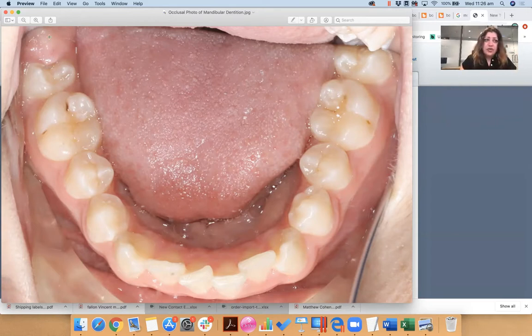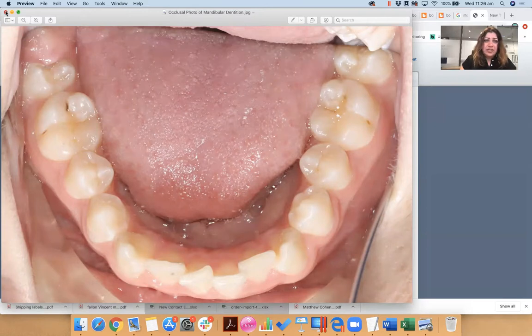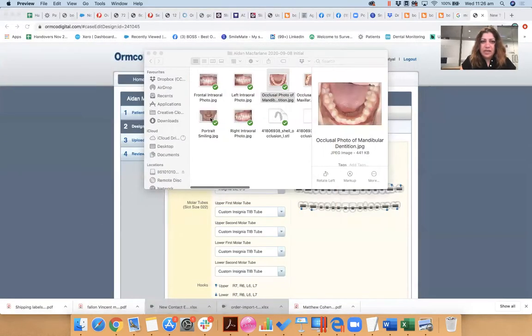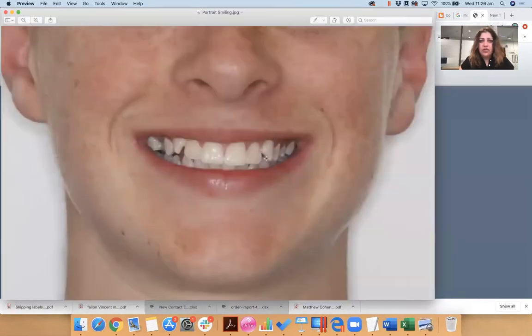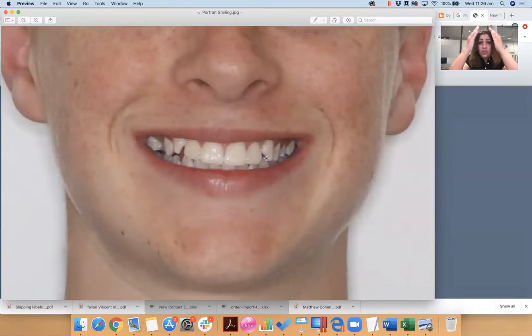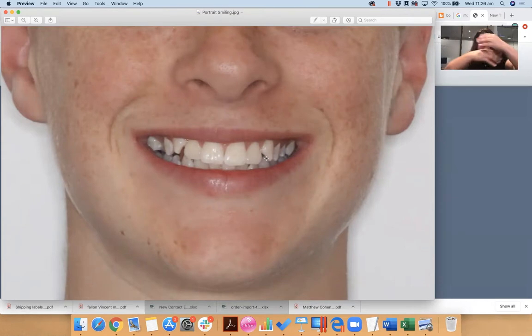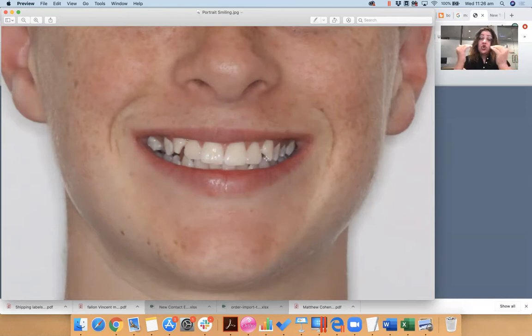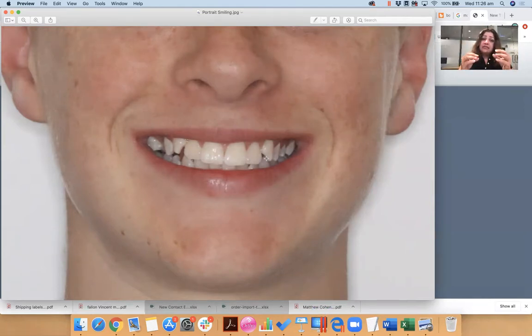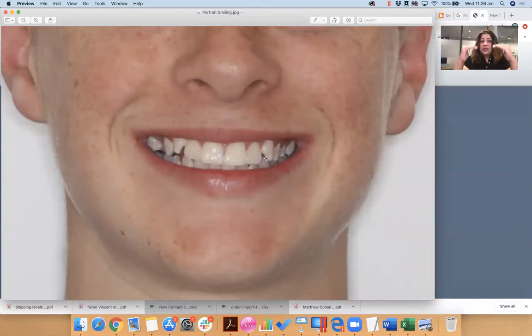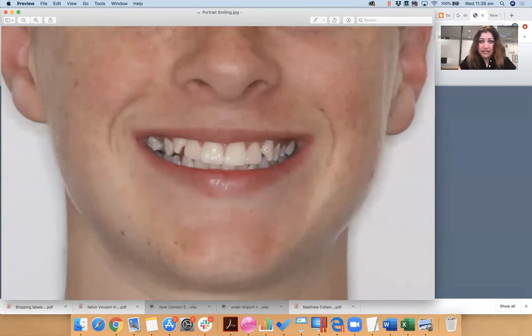So always start with the smile. Always start with your central incisor. Make sure you know, where is the 1-1, 2-1 going to go? Once you know the 1-1, 2-1, you design everything from there, right? So we know his 1-1, 2-1 could afford a bit of extrusion and we know that definitely 1-1, 2-1 cannot be intruded, right? Once we know that, we develop everything else based on that, right?